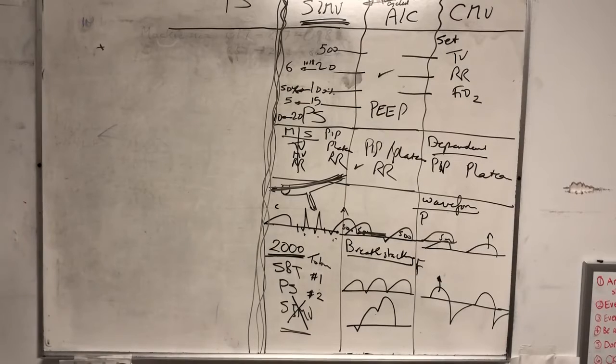So for pressure support, this is the simplest mode of ventilation. I would call it, more people are familiar with BiPAP now than vents. So unfortunately, I have to tell people that this is the BiPAP of the vent. This is like the BiPAP of the vent, exactly.